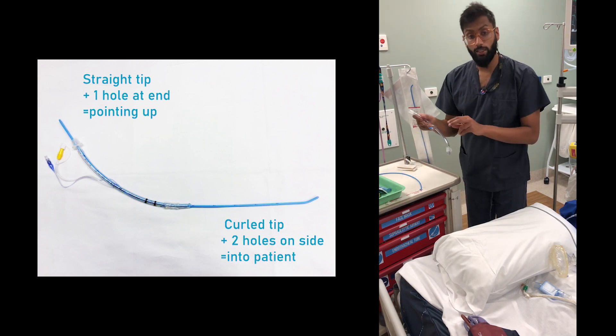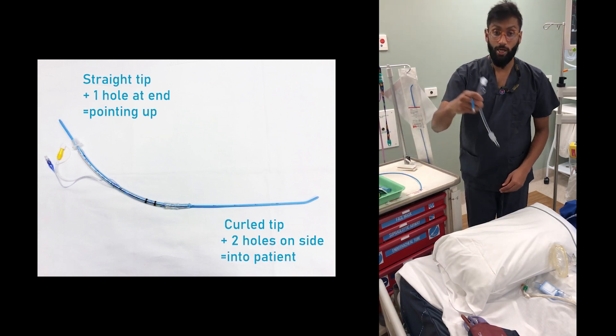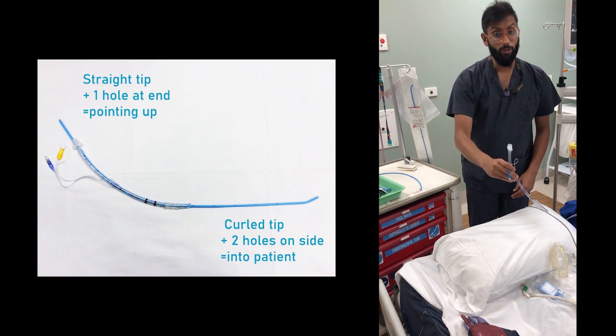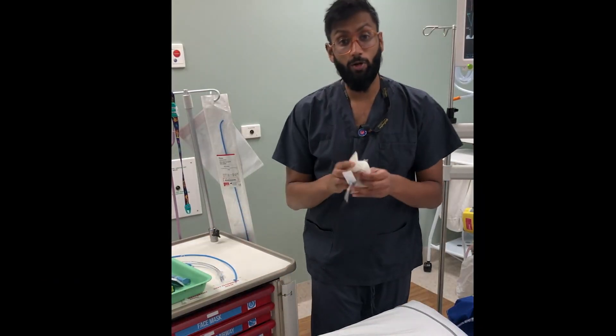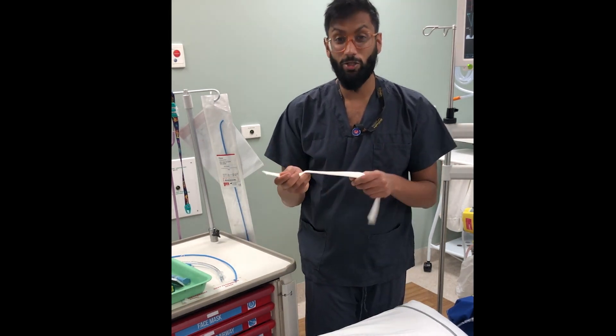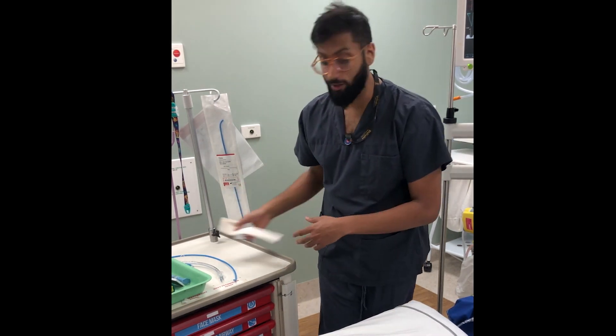The same goes with the ET tube — make sure it's lined the correct way so you hand it over to the operator and they can just put it in the patient. Make sure you've got your ties ready. These ties should be around your patient ready to go, so your tube can be secured, because after you've gone through all this effort, you don't want it falling out.